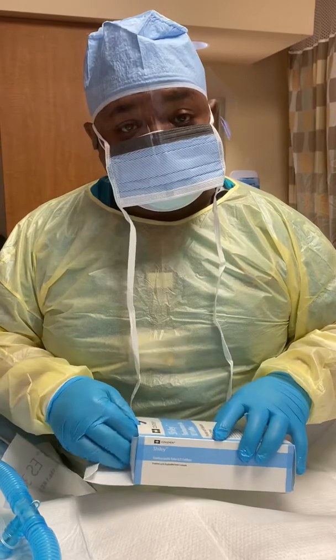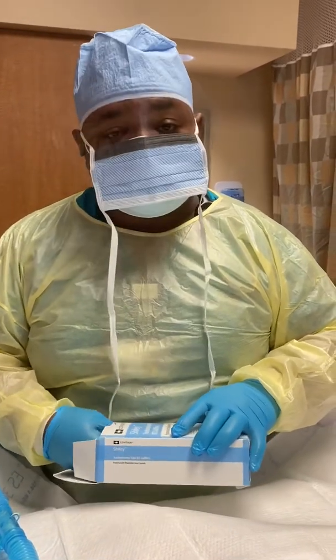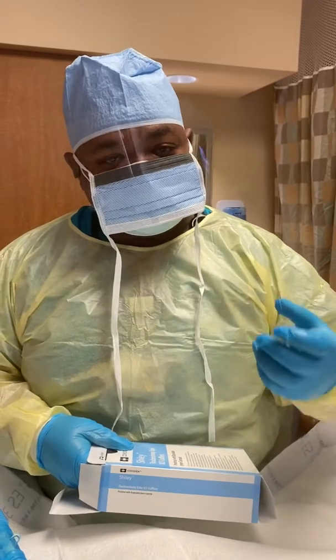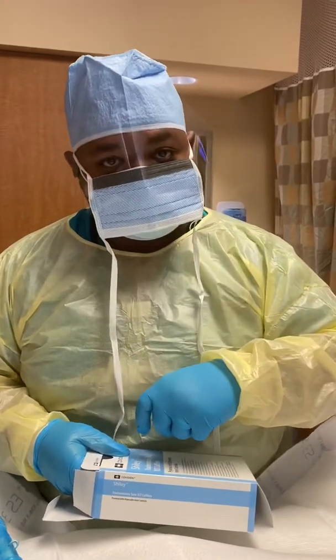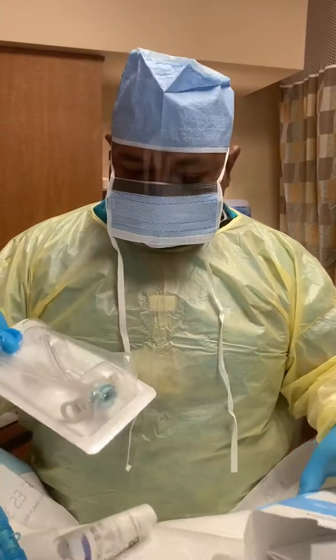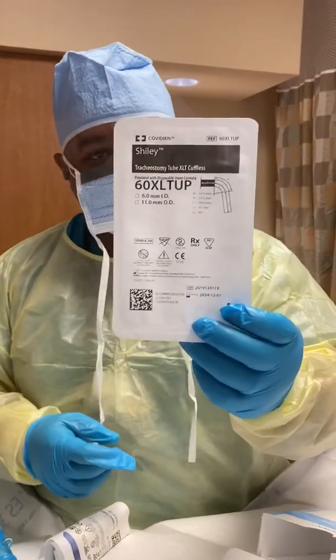All right, guys, it's Mr. McCarthy here. We're going to change a tracheostomy — take the whole old one out that has a cuff in it and put in a new one without a cuff so that the patient can talk better. We're going to be putting in an extra-long trach.